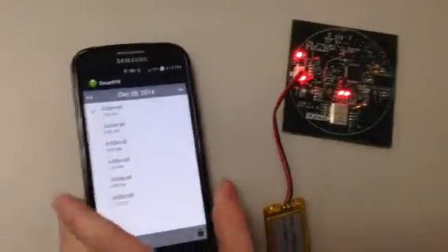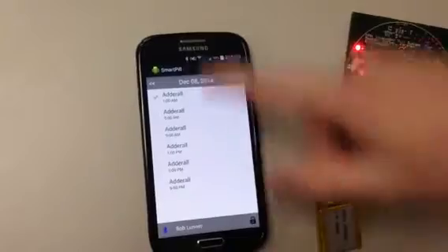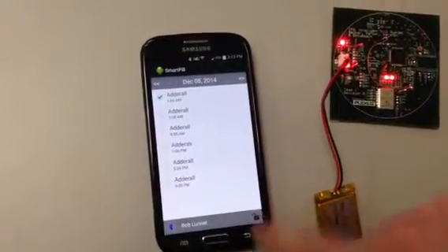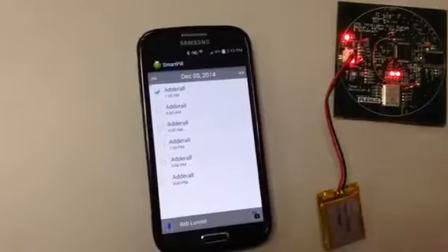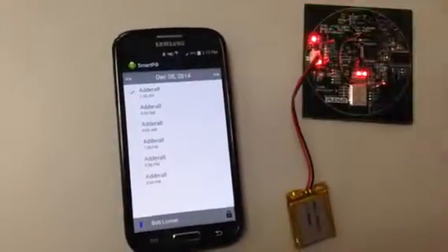Then in the Android application, the patient can see all the times that they have to take their medication, as well as the times that they've already taken it, which can be updated with this. They can also go in and check these off manually if they want to, if, for instance, they took it by accident or they didn't actually take the pill, but it still triggered one on the device.